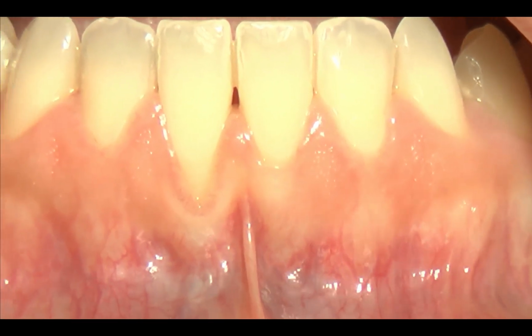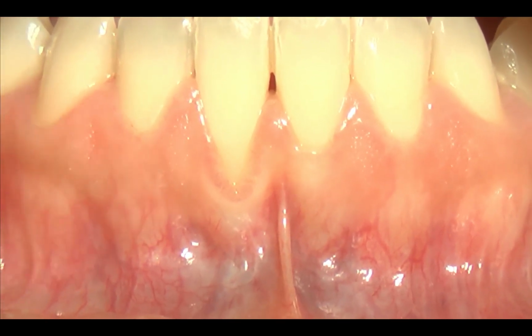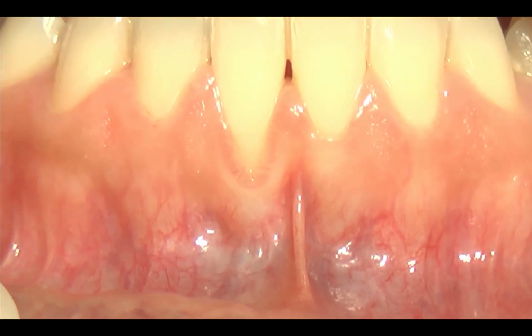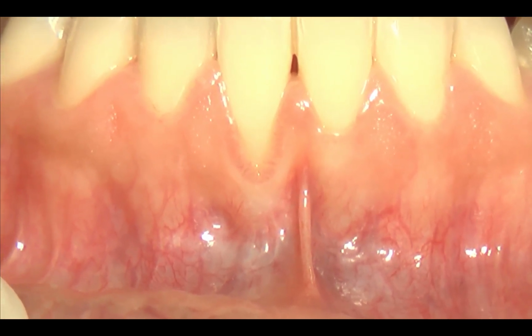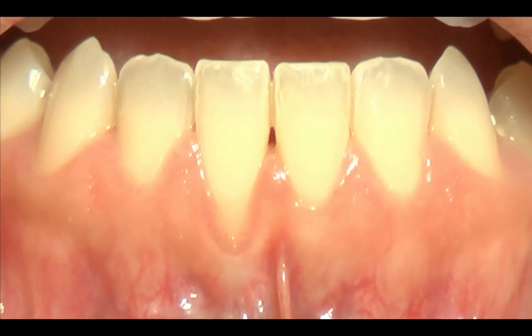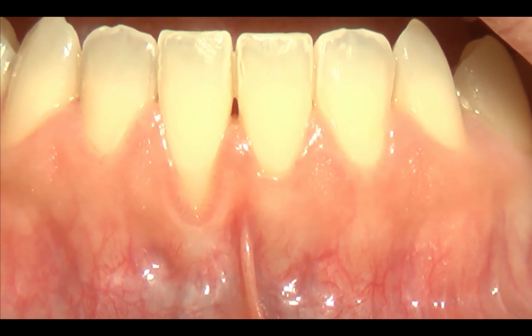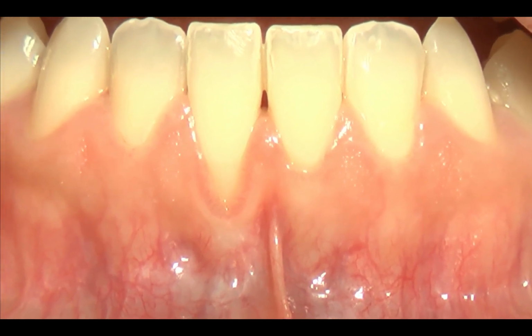You can see here the presence of a shallow vestibulum depth, and you will see it after anesthesia. And this is why treatment in the lower incisors is much more challenging with respect to the treatment of upper jaw.